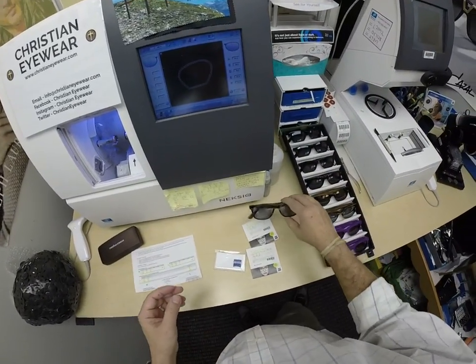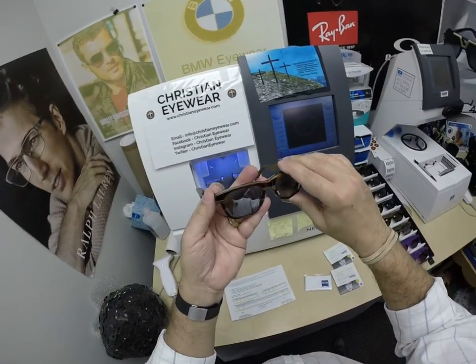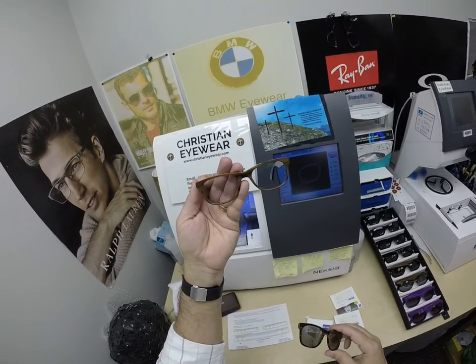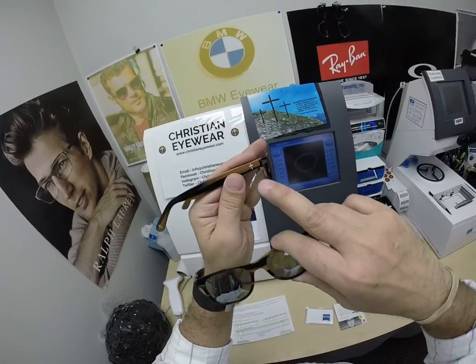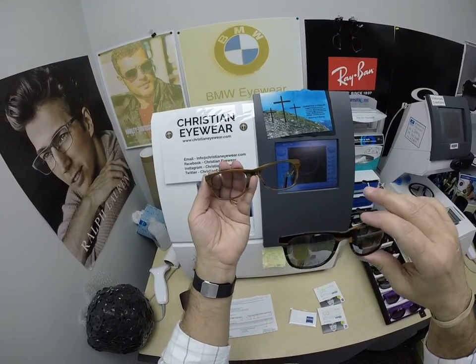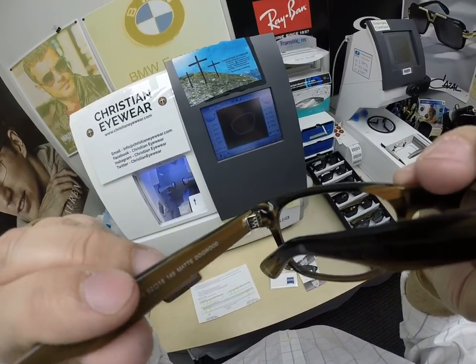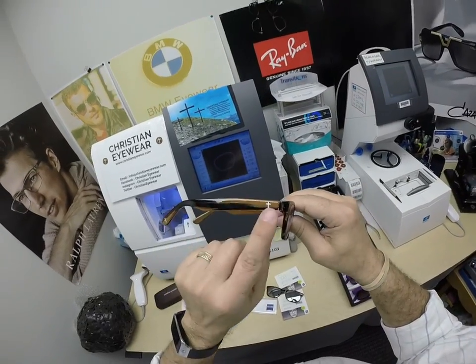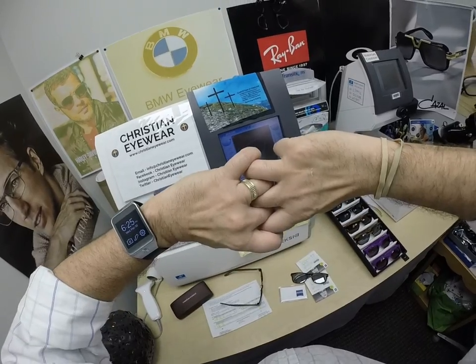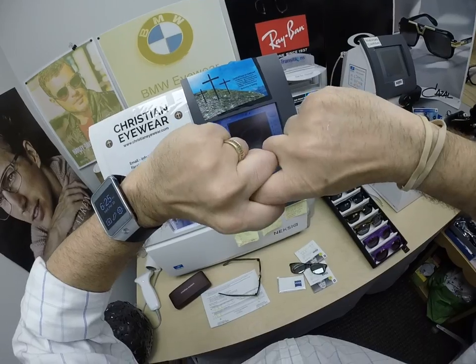This is modeled after the Ray-Ban 2132 New Wayfarer — a frame I wore for years with my clear lenses in it. I sent one to the manufacturer and said: this is what I want, don't put Ray-Ban on the side, put the Christian cross. And I put the strongest hinge possible. The Ray-Ban comes with a three-barrel hinge; this is a seven-barrel hinge — the temple has four barrels and the frame front has three, so when you put in the screw, that's a seven-barrel hinge, the strongest you can have on a pair of glasses.